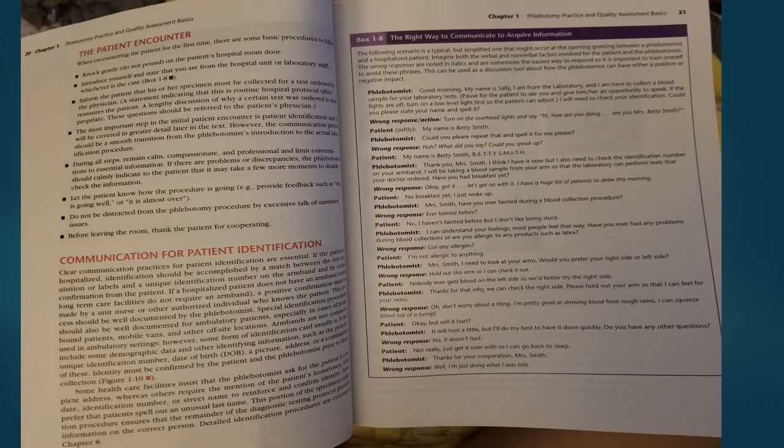Let the patient know how the procedure is going. Provide feedback, such as, "This is going well," or "It's almost over." Do not be distracted from the phlebotomy procedure by excessive talk or unrelated issues. Before leaving the room, thank the patient for cooperating.